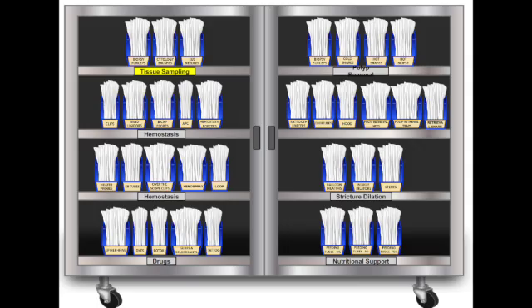Second, abdominal pain, maybe suspecting H. pylori. The stomach might look fine on camera, but you still biopsy. You absolutely take biopsies. H. pylori can be there without obvious inflammation sometimes.